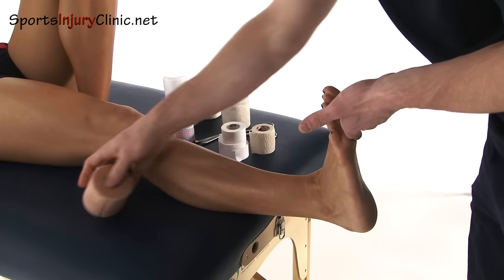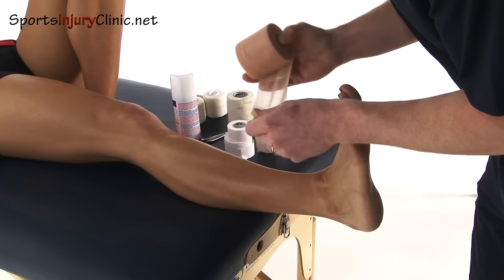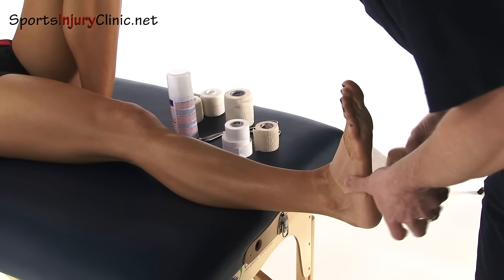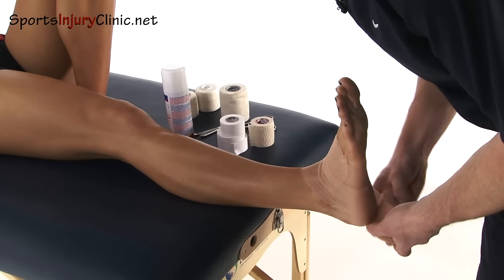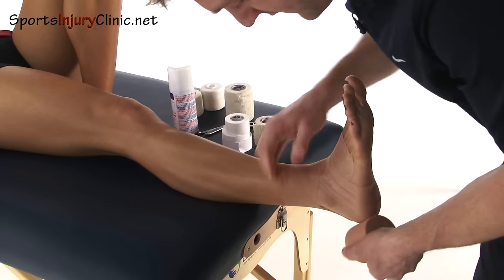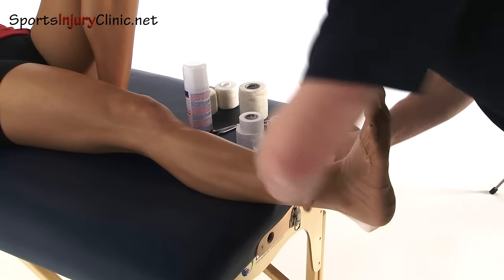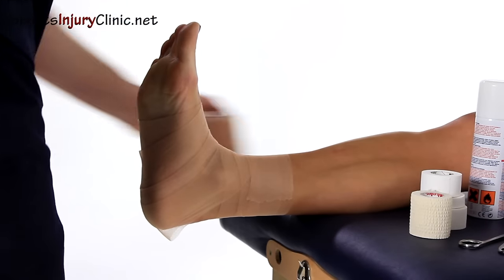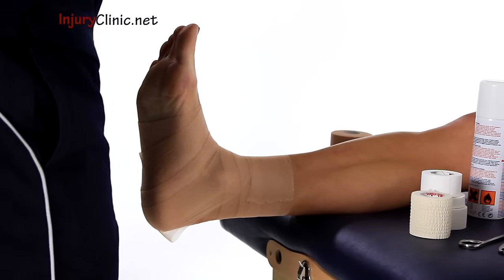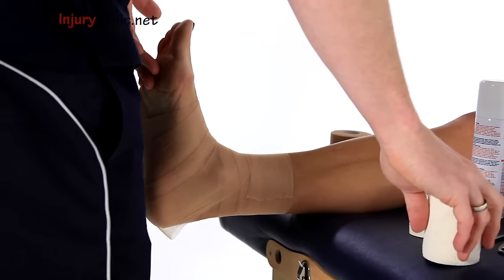I'm going to show it with the underwrap first. The underwrap is just rolled around the ankle, keeping it in contact the whole time. That's just a base layer — it has nothing to do with the actual tension or strapping we're trying to achieve for the ankle.